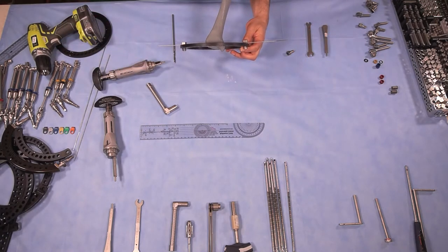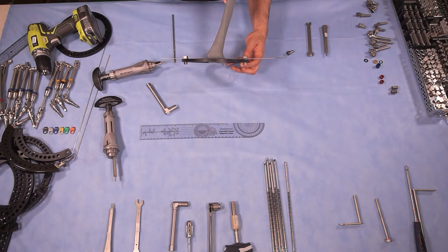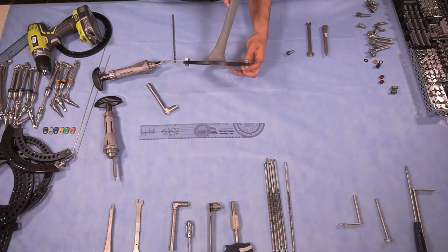You can see that this ring is pretty orthogonal to the joint. This particular system also has carbon fiber rings that would allow you, during follow-up, to see every structure you need, even through x-ray.